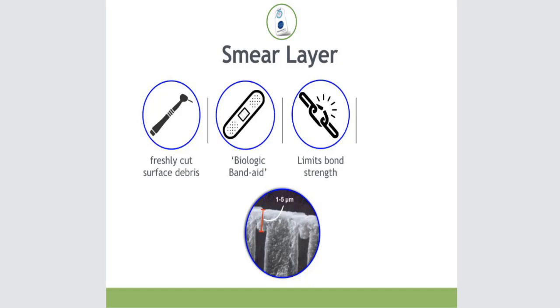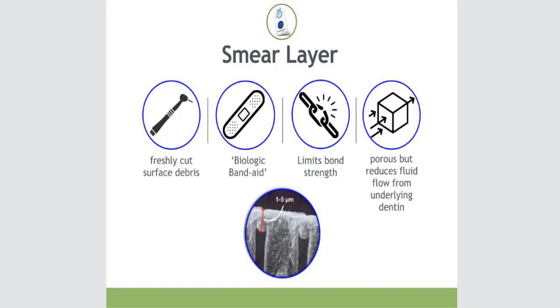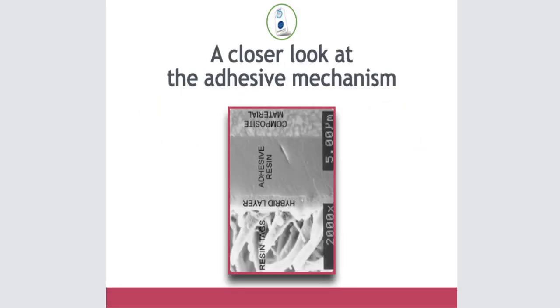It limits the bond strength, and it is porous, and it reduces the fluid flow from the underlying dentin. So we have to deal with this in any adhesive that we use. Well, let's take a closer look at the adhesive mechanism, because what I want you to do when I talk about adhesives, I want you to think about how you use your adhesives, the clinical situation, because we use our adhesives every day. I want you to think about the clinical situation that it's used in, and really how you use it. How do you and your assistant utilize your adhesive, and really what type of adhesive are you using?